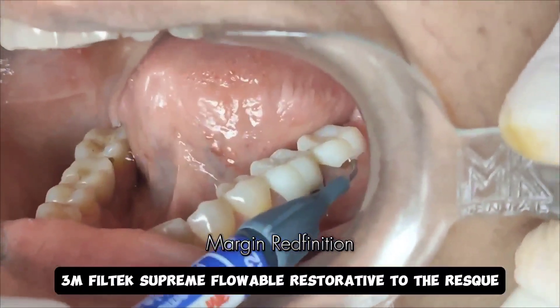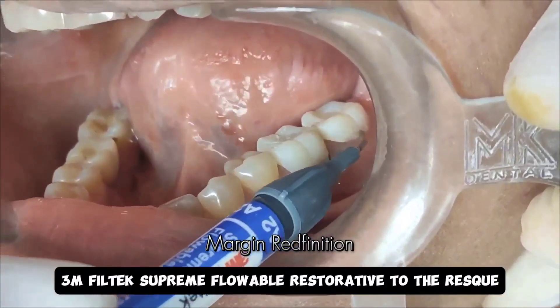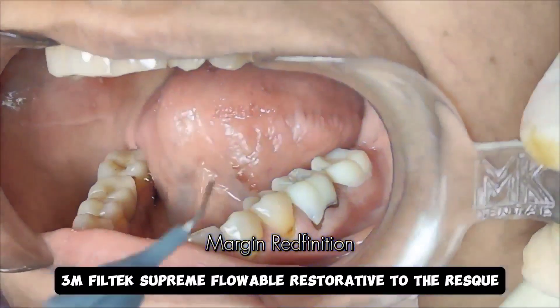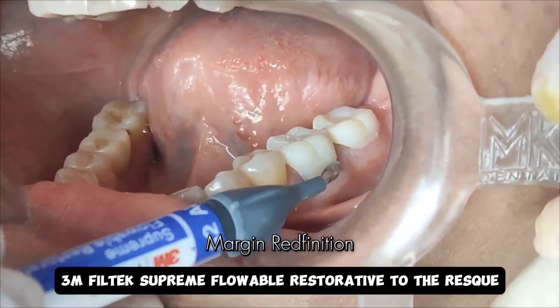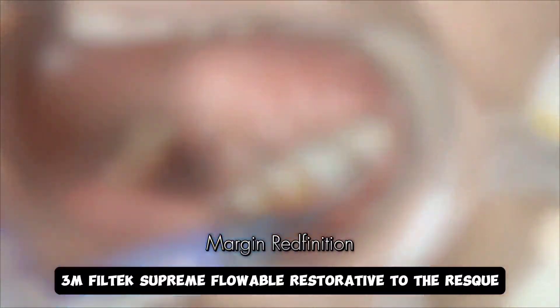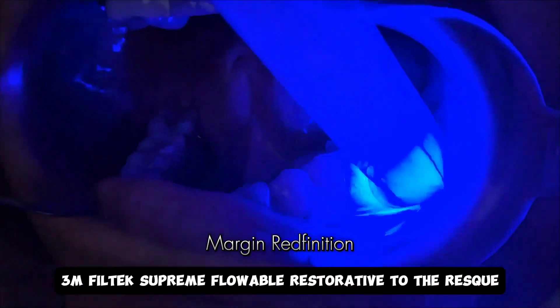A short video where I explain the concept of margin redefinition using Filtek Supreme Flowable. You can appreciate here that I have made a couple of provisional restorations for those mandibular molars, and the margins were not exactly where I wanted them.